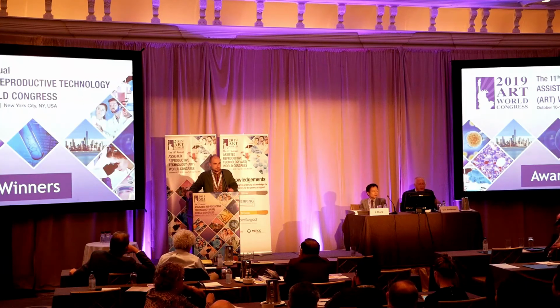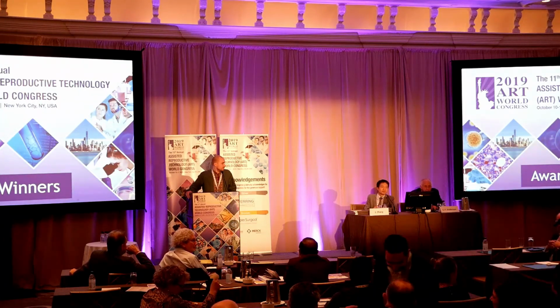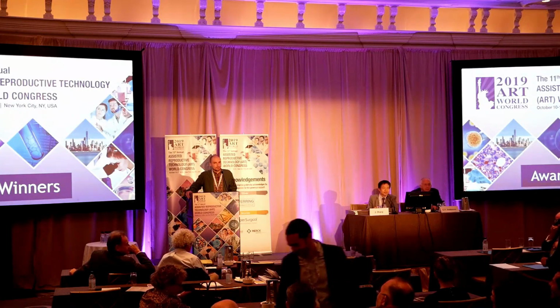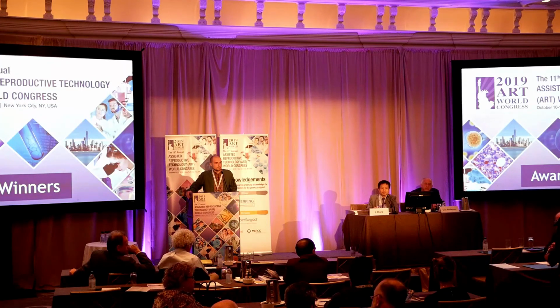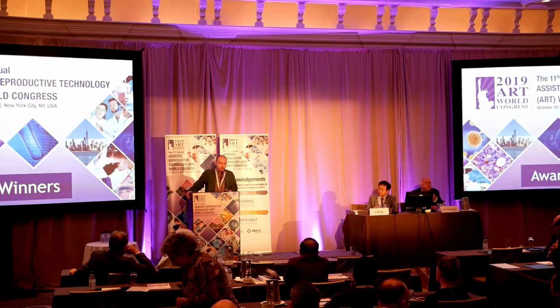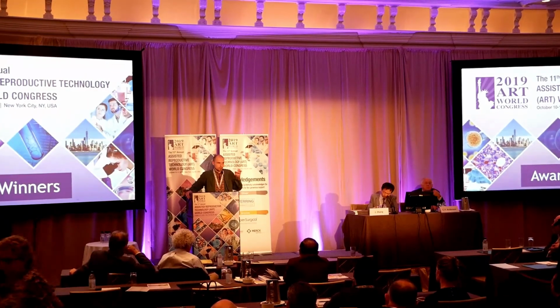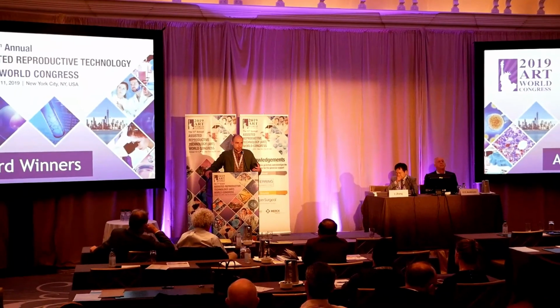Okay. Thanks. Very good. Last question, please. Yes, go ahead. Excuse me, is it necessary to use electrofusion in your technique after injection? Well, there are no other options. When you remove something from the cell, you cannot put it back. It will not be sucked in by itself.